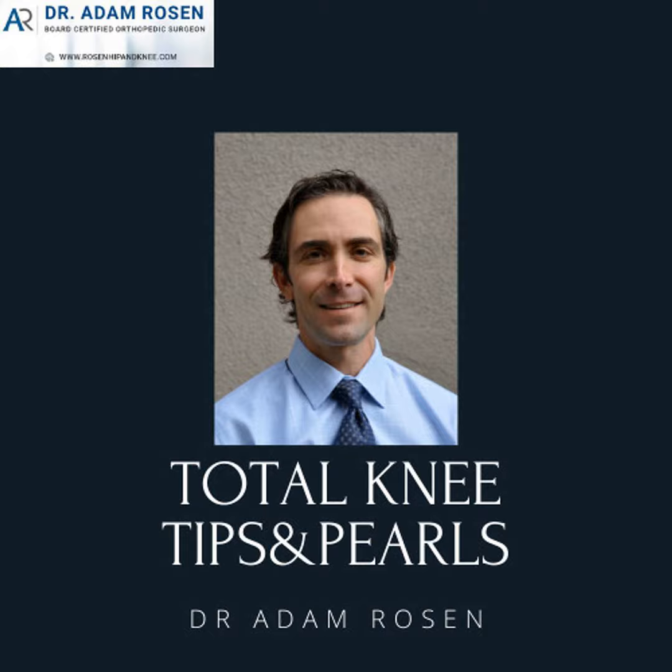In the arthritic world, we're also discussing osteophytes and subchondral cystic changes and sclerosis, because you may not worry about it now, but when you get out into practice, having the verbiage of severe arthritis and osteophytic changes matters. Those are the silly buzzwords that somebody at the insurance company with a 3-ring binder checks a box on to say, oh, they're approved for knee replacement. So it's important to have all that. Do they have retained hardware? Are there changes consistent with old removed hardware? Did they have an old HTO? And then do they have a patella baja? Do they have a patella alta? So again, you're making all of these comments to explain to the viewer what they're seeing.